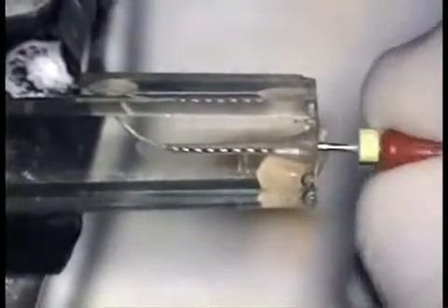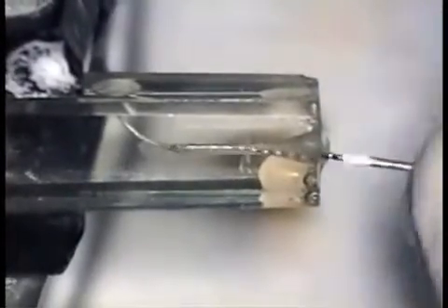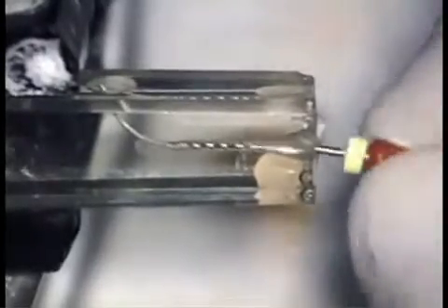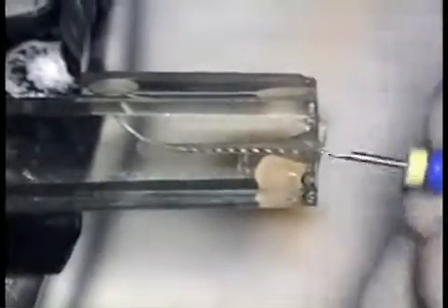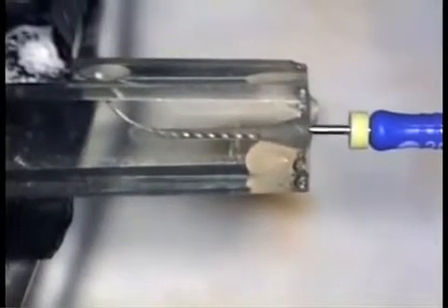After the tapered piezo, I checked for patency using the number 25 relieved reamer. Please note how easily it gains full apical length. The number 30 now goes strictly up to what would be the constriction, using a series of short arc strokes. At no point am I ever using increasing amounts of apical or torsional force.